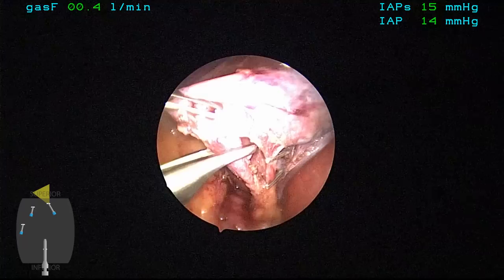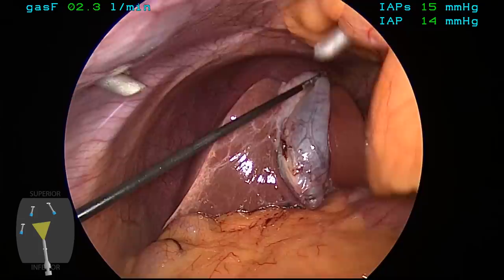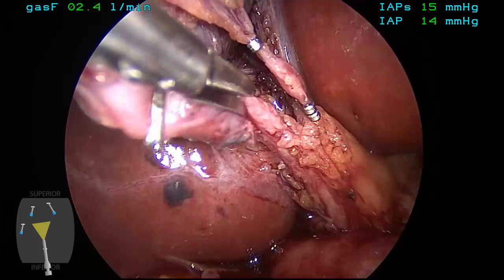The cystic artery is clipped first with two clips on the stay side and one on the side to be removed, and then one clip on the neck of the gallbladder. We then switch back to the 10-millimeter camera at the umbilical port. And now we're going to attempt to do a cholangiogram on this patient. The cholangiogram is done through the mid-clavicular port.